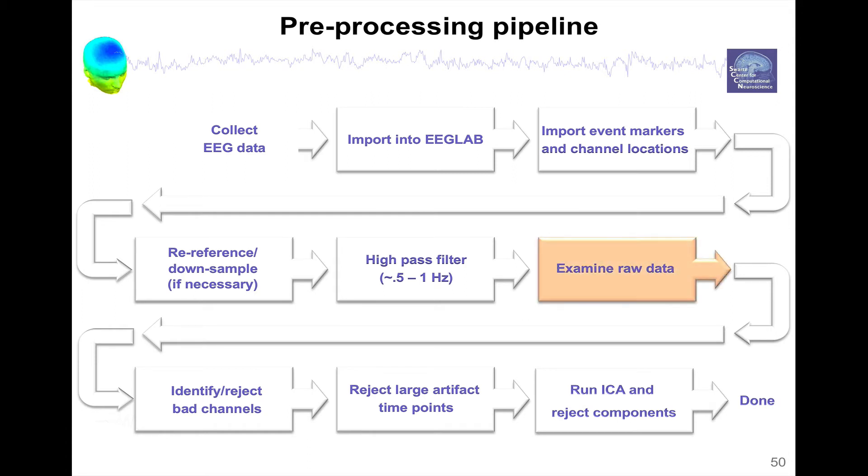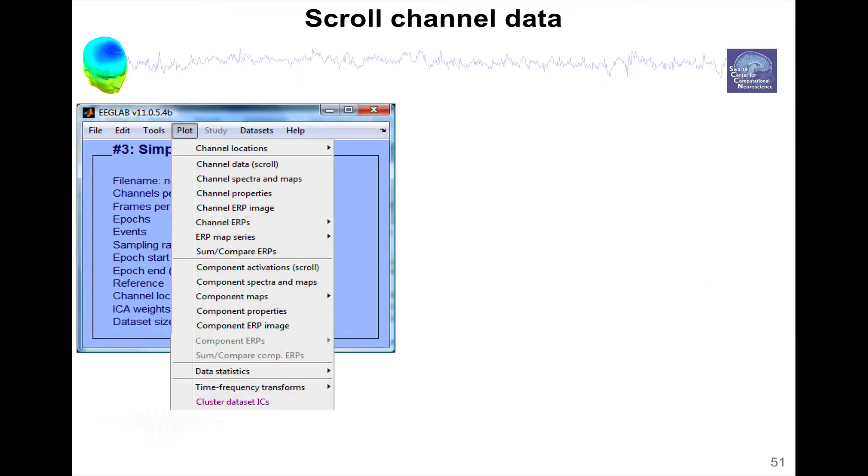So we are now at this step, we just finished filtering. Examining raw data, there are two ways to look at raw data in EEGLAB.